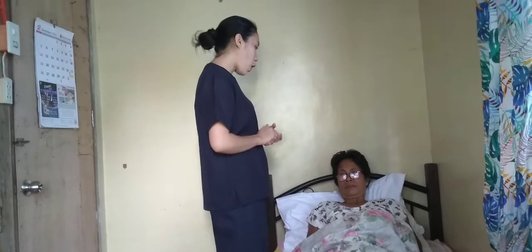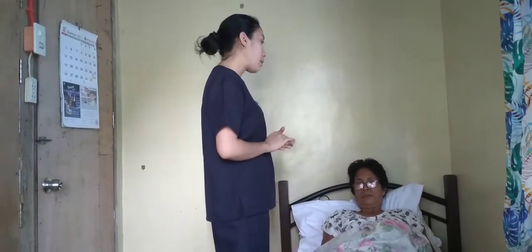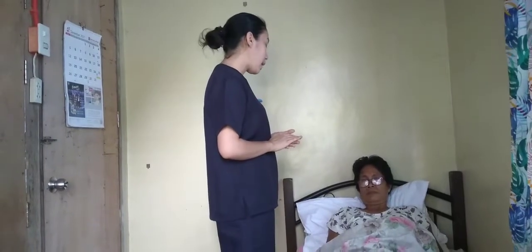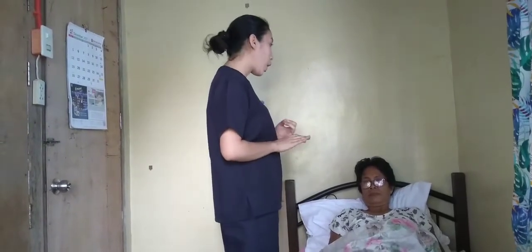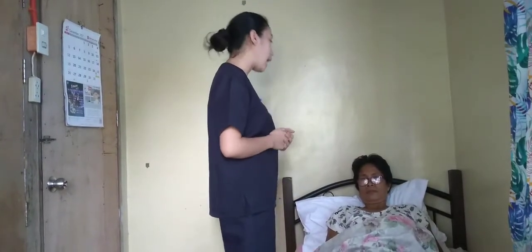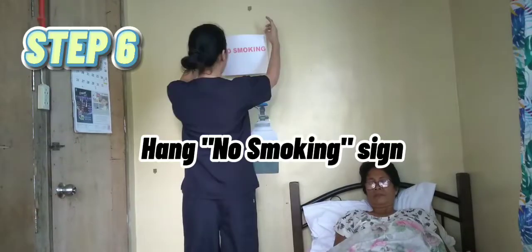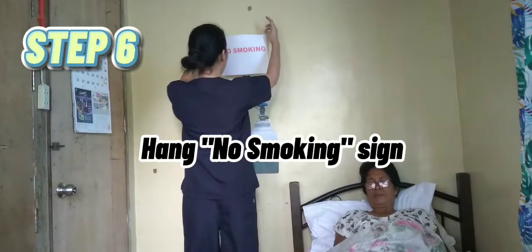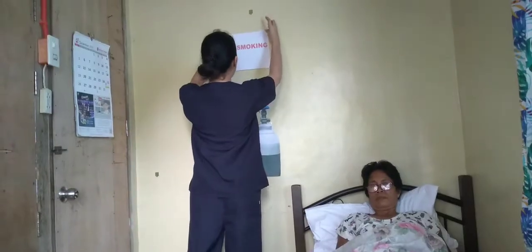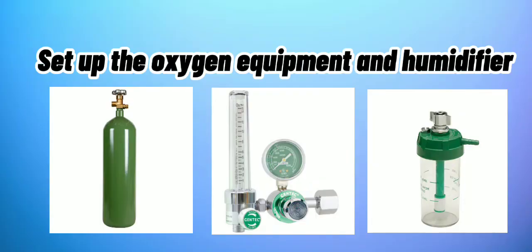Explaining to the patient in the local language: the oxygen to be used is not dangerous, but there should be no smoking and no use of alcohol, oil, or grease near the patient receiving oxygen. Step number six: hang a 'No Smoking' sign in a place easily seen by all in the ward.